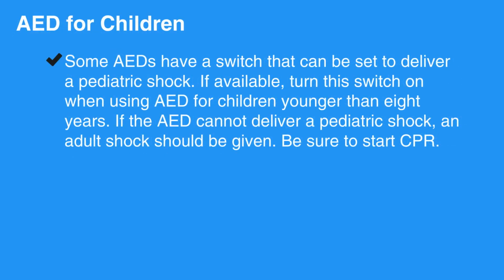Some AEDs have a switch that can be set to deliver a pediatric shock. If available, turn this switch on when using AED for children younger than 8 years. If the AED cannot deliver a pediatric shock, an adult shock should be given. Be sure to start CPR.